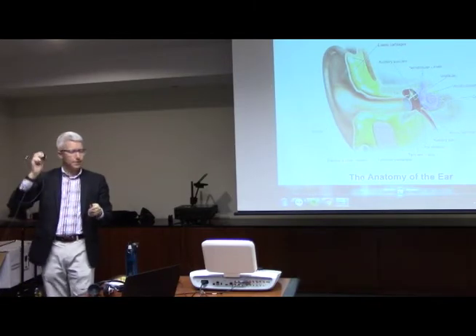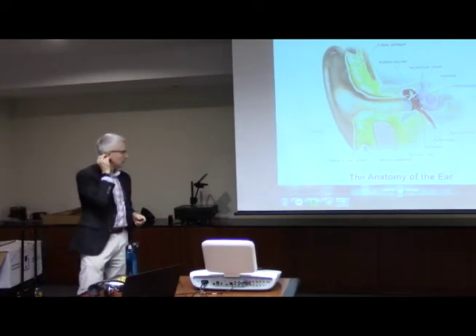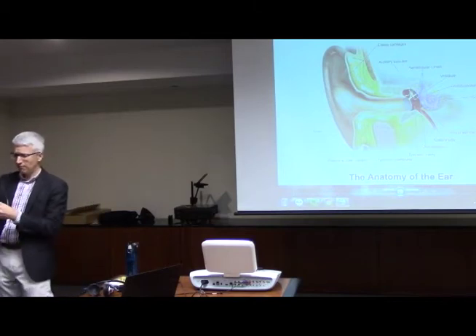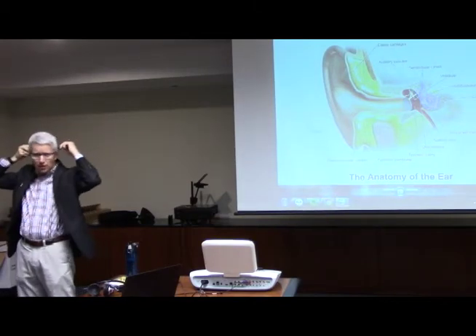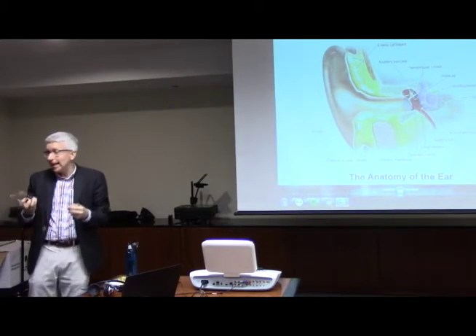And what this does is this actually sits right behind the ear. The bone is called the mastoid, so it's the bony part right behind your ear. Not the most comfortable to wear. I don't know which is worse, where that sits on the mastoid or where this comes across and just digs into your temple right there. But it's not designed to be comfortable.